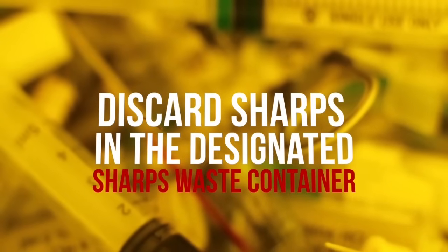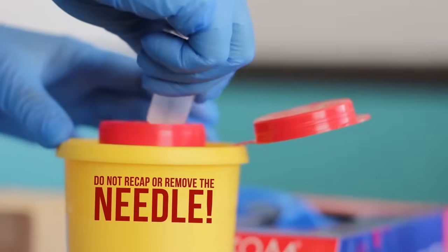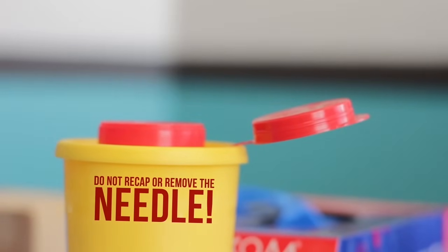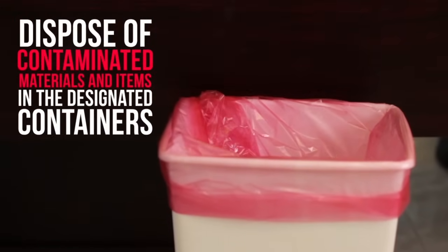Discard the used syringe and needle in a designated sharps waste receiver. Do not recap or remove the needle. Remove gloves and discard in a suitable medical waste bin.